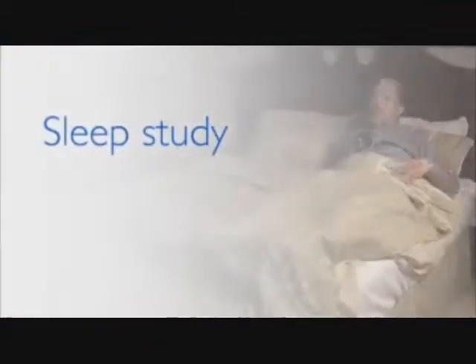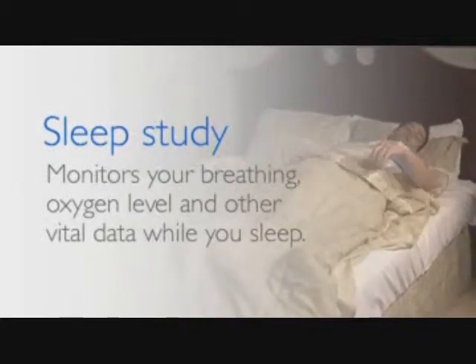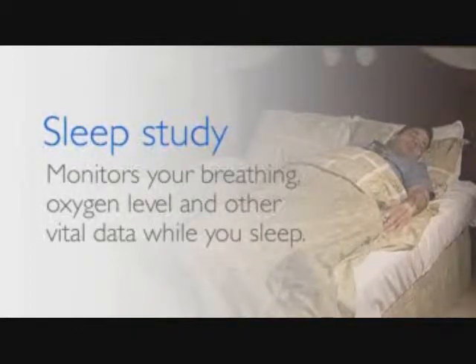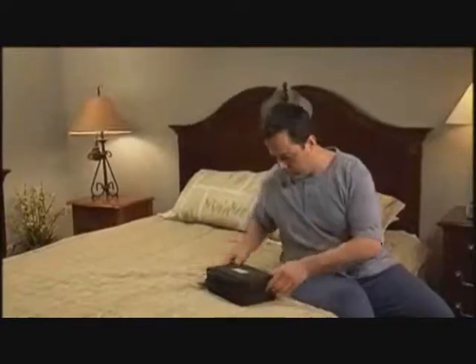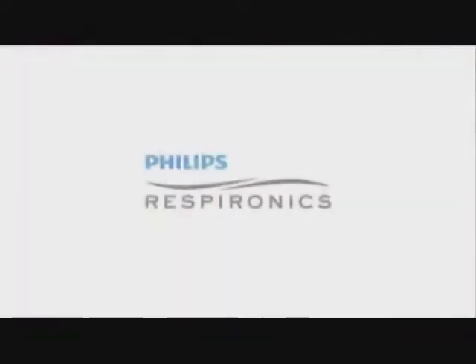The standard method to determine if someone suffers from sleep apnea is a sleep study. This is a simple diagnostic test that monitors your breathing, oxygen level, and other vital data while you sleep. If you are watching this video, your physician has recommended that you have a sleep study.